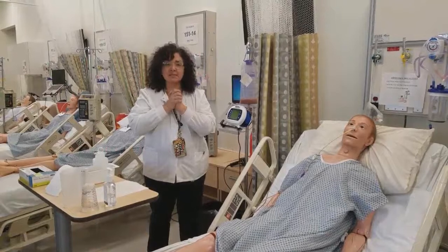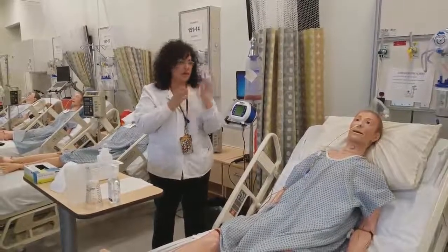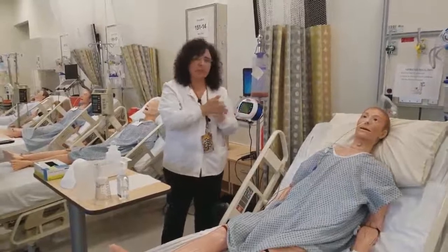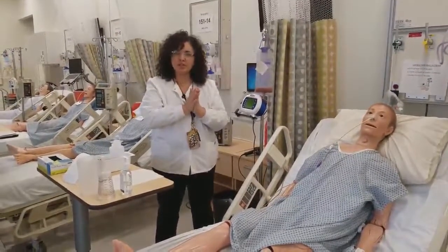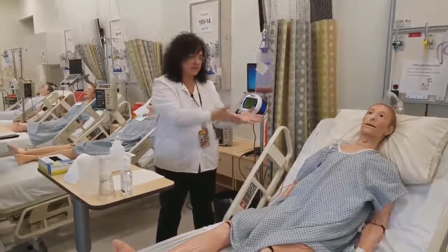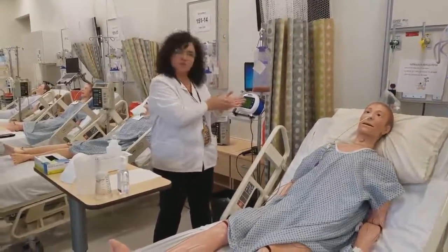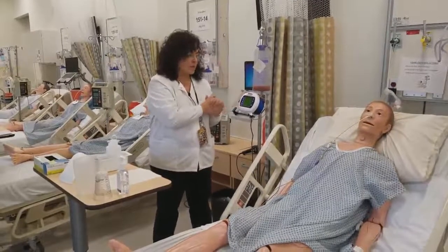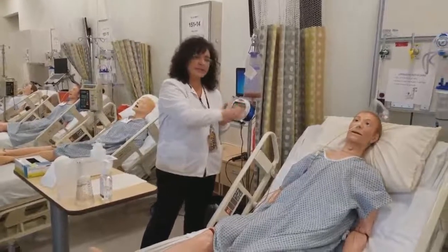In this presentation, I'm going to be demonstrating how to give medications down a feeding tube. And in this case, we're working with a CORPAK. Let me just set up the situation first before I get started. This is Duke Blue Devil, my patient, and he's receiving tube feeding. And it's going at a continuous rate through his CORPAK that is in the stomach.